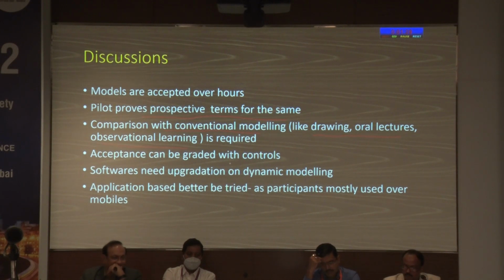Acceptance can be graded with controls. Software needs upgradation on dynamic modeling. This is again a part of discussion. Whatever I have shown is static modeling. So dynamic modeling is when you apply force, a surgical force on the cornea, it tends to get deformed.